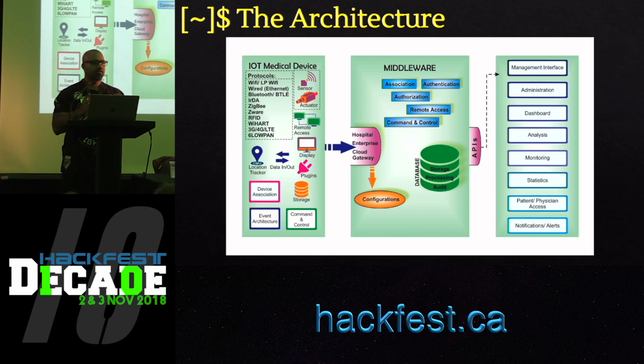Event architecture is the key module, which basically takes data and then creates an event based on that data. And then for some of the devices, actually, for most of the connected medical devices, there will be some sort of command and control module, which would allow manufacturers to remotely maintain the device and upgrade it and so on. Could also be used by the attacker sometimes.